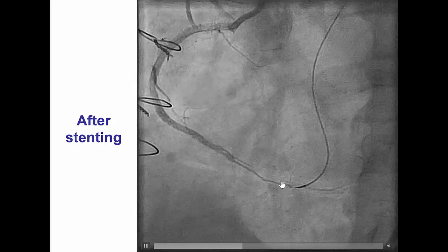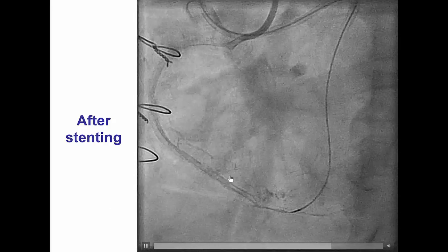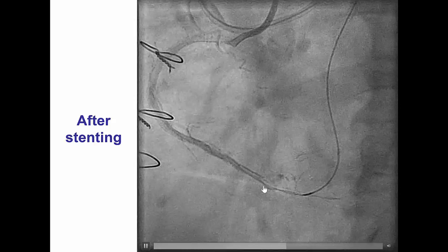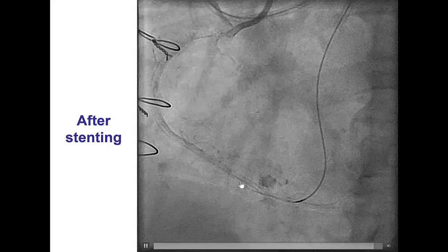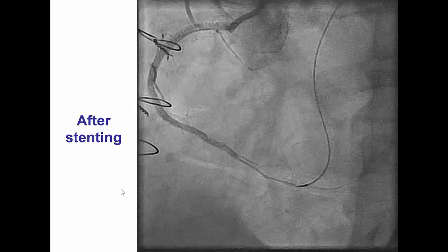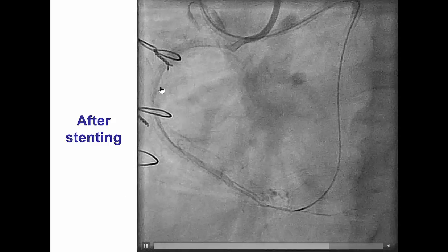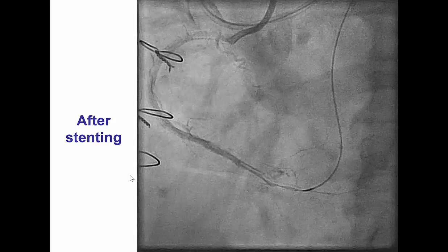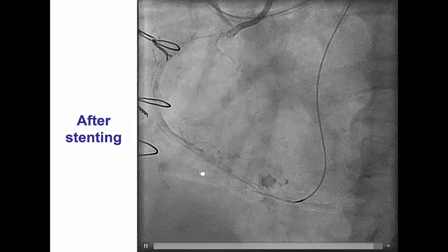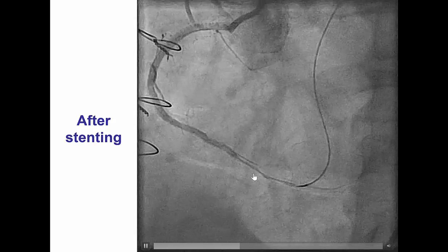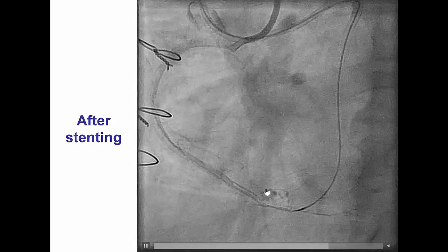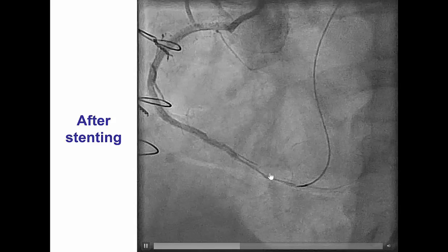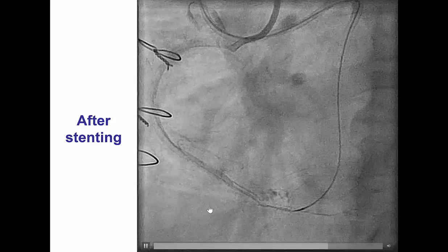When a perforation like this happens, the very first step is to perform balloon inflation and stop the bleeding into the pericardium, which we did. However, the perforation continued. This was a patient with previous coronary bypass graft surgery, which creates additional risk for pericardial tamponade if perforation occurs, because localized effusions can form that can compress various cardiac structures.